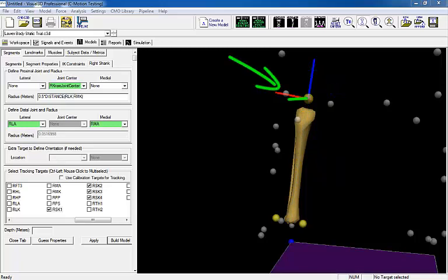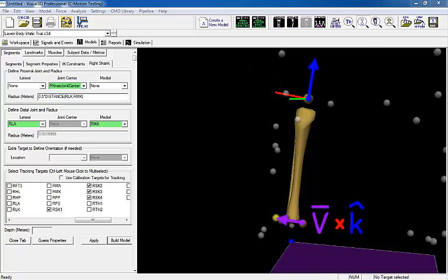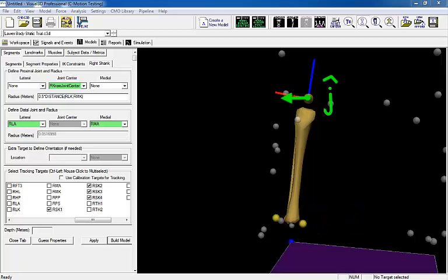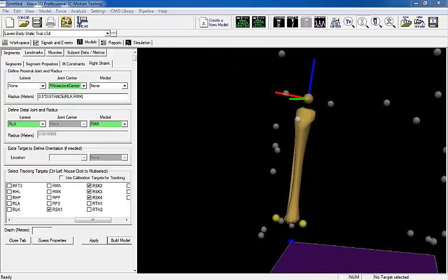Visual 3D then defines the AP axis of the segment by drawing vector v from the medial and lateral targets of the segment, taking the cross product of vector v and the unit vector used to represent the distal-to-proximal axis, then finding the unit vector. Visual 3D defines the medial-lateral axis of the segment by taking the cross product of the two unit vectors that were just defined.